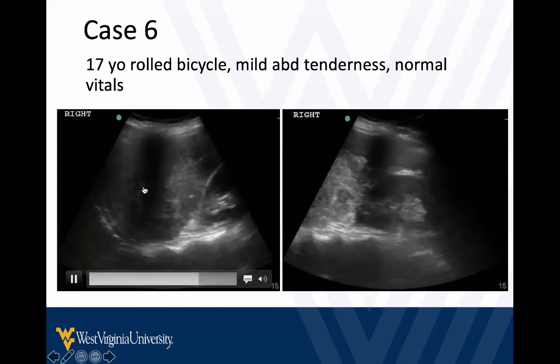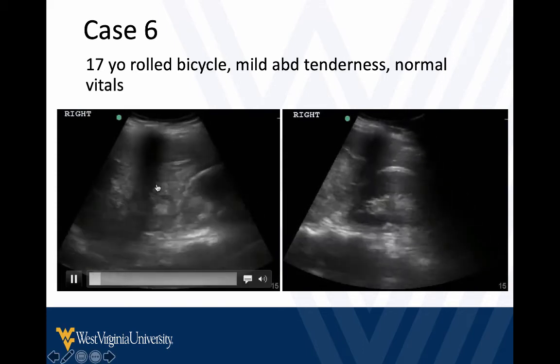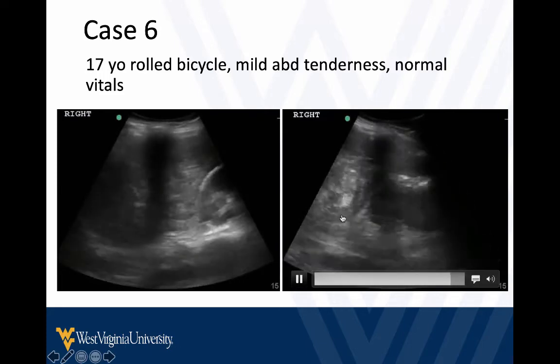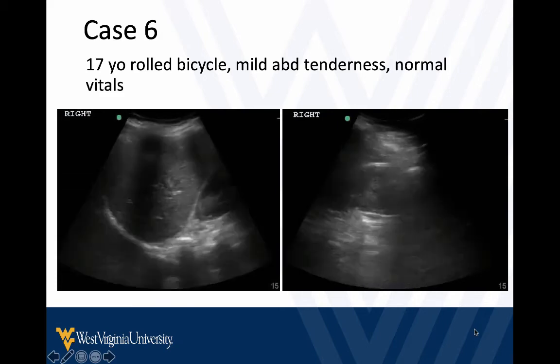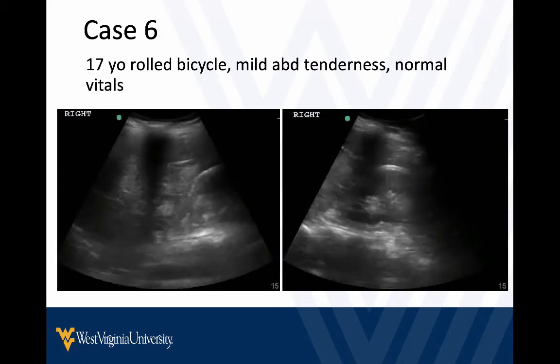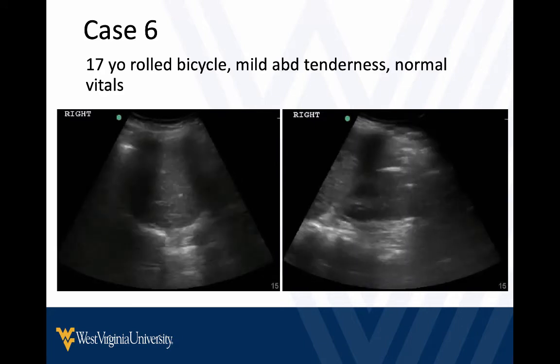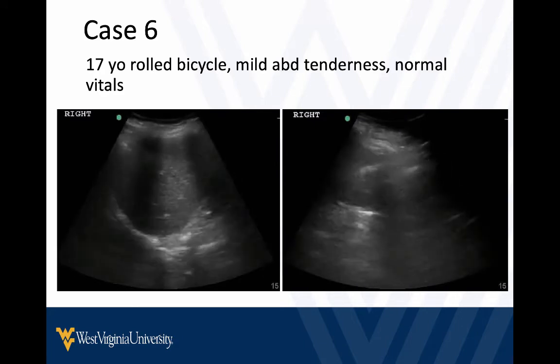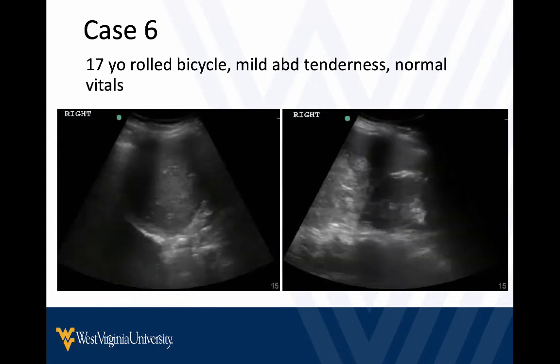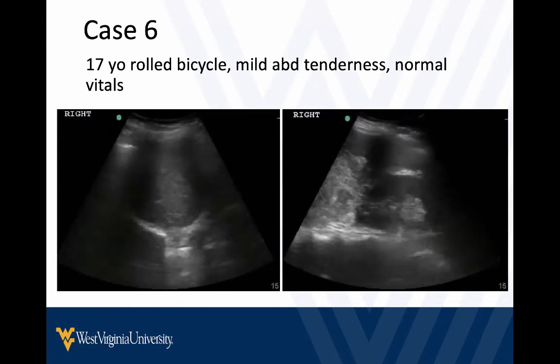Maybe we see this liver changes echogenicity here, it gets brighter. There's some brighter white than we would normally see in the liver here, so maybe that's a clue that this patient has more going on than just some mild belly contusion and maybe needs further workup, further attention. And if you're in an outside facility, you would think about how you are going to triage resources and manage getting this patient to more definitive care.